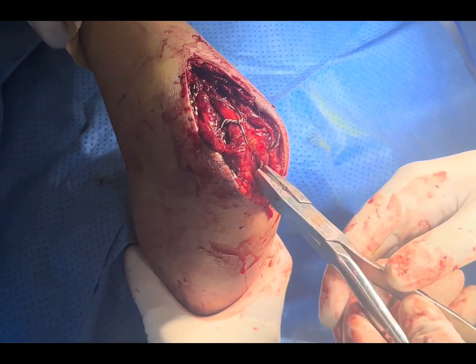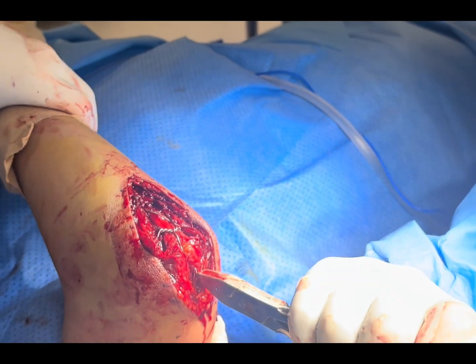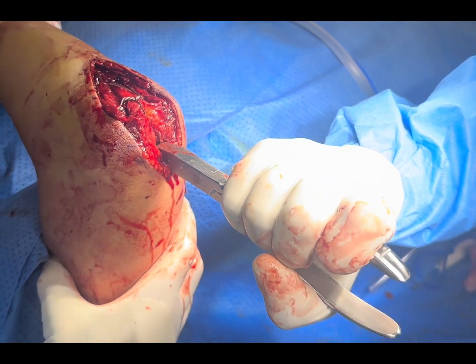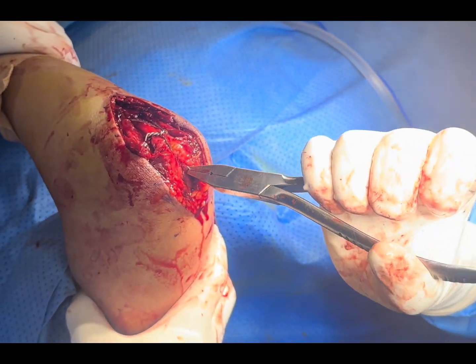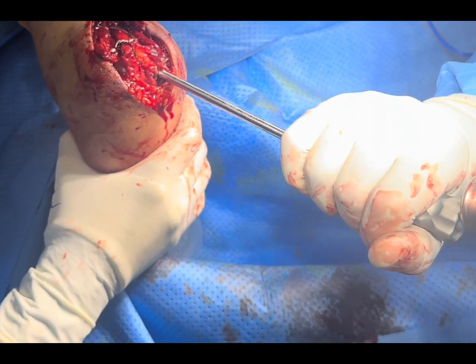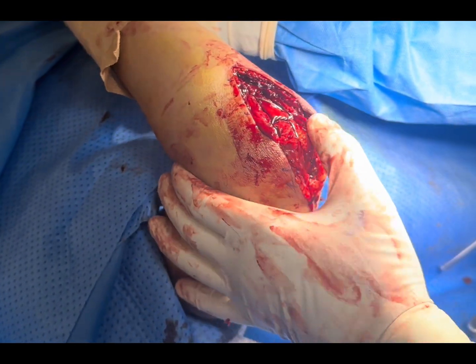We have cut this one and now we are going to bend it. Now we will impact a little bit. Hold this one — I need the impactor. This is a screwdriver, big one. Now you can see the movement — the structure is well aligned and stable.